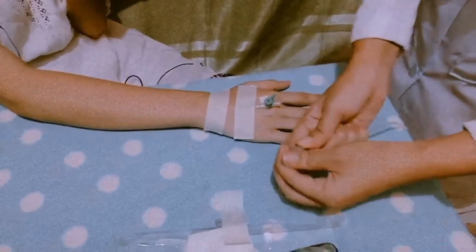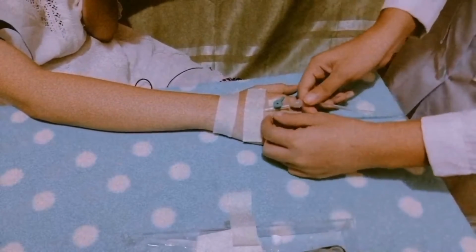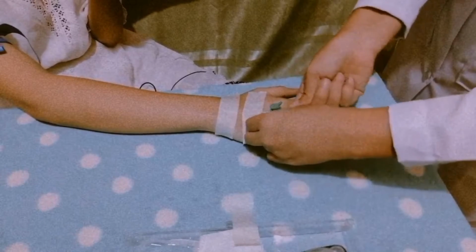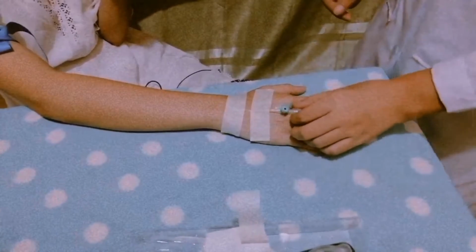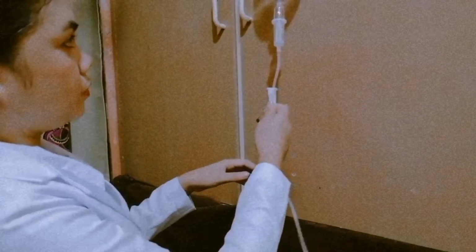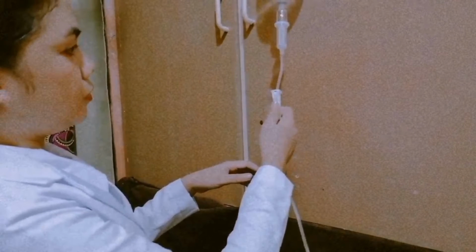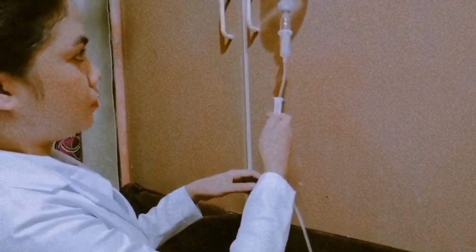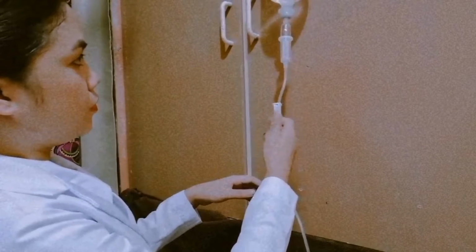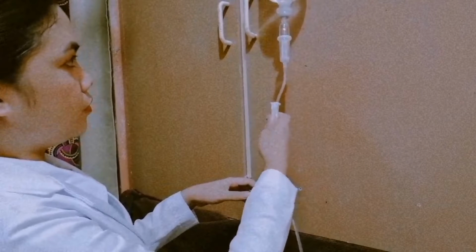Next procedure is to connect the tubing to the needle. Then start the flow of solution promptly by releasing the clamp on the tubing. Examine the site for signs of infiltration. Blood will clot readily if IV flow is not maintained. If the needle accidentally slips out of the vein, solution will accumulate and infiltrate into surrounding tissue.